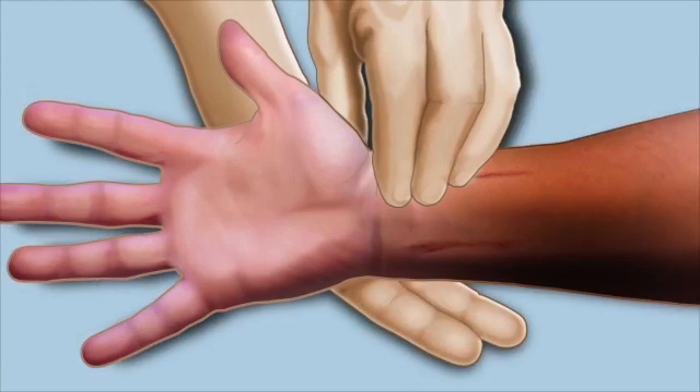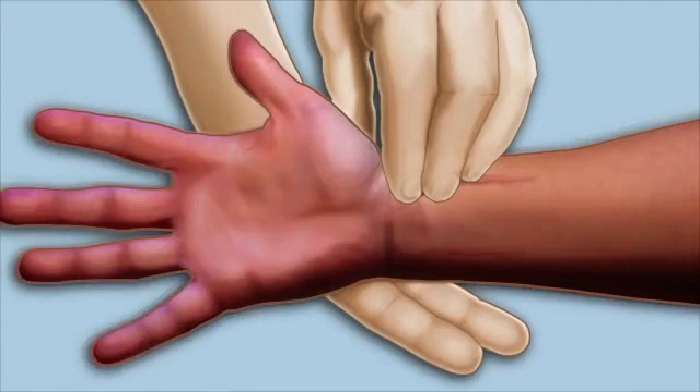The patient's hand should appear blanched. Compression is then removed from the ulnar artery while maintaining pressure on the radial artery. Look to observe a return of blood flow within 10 seconds. The return of blood flow demonstrates a negative Allen's test and indicates that the site is acceptable for radial artery catheter insertion.